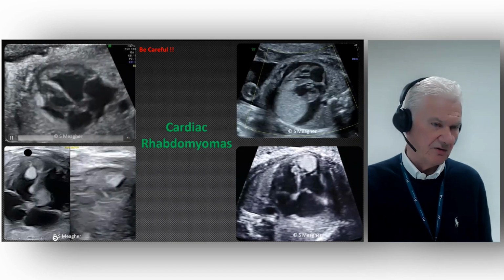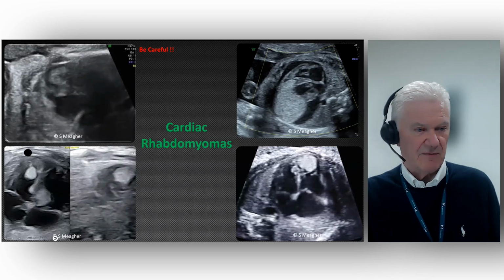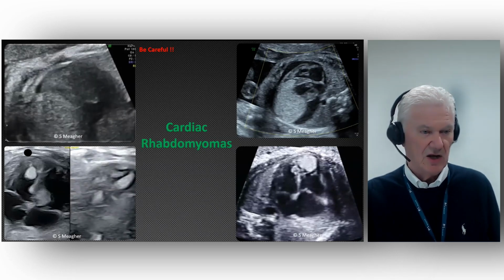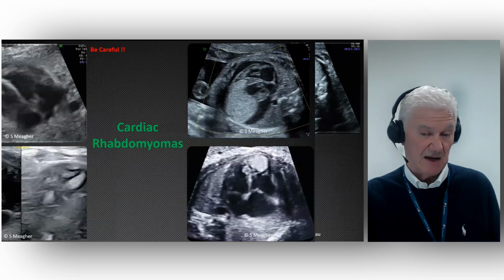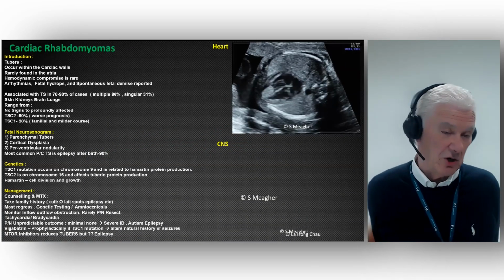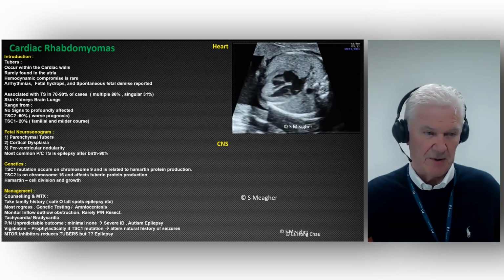This is not a cardiac rhabdomyoma. This is a normal moderator band. And some of these will require review again later in the 3rd trimester to ascertain whether they are single or multiple. Why would I worry about cardiac rhabdomyoma? To be honest with you, I don't, because cardiac rhabdomyomas pretty much universally resolve after birth.